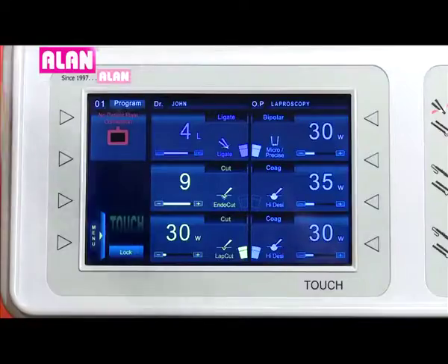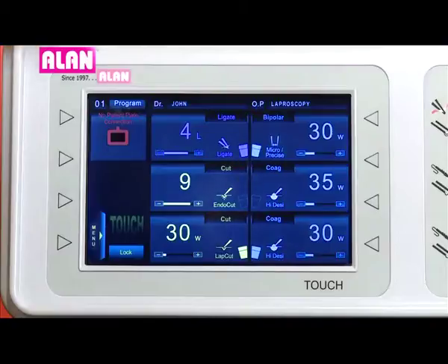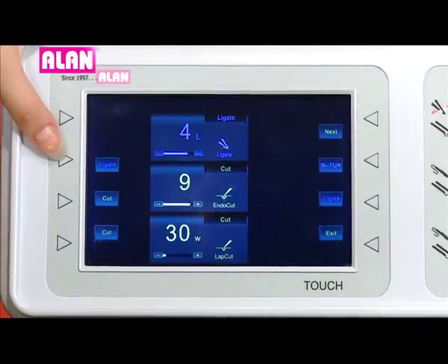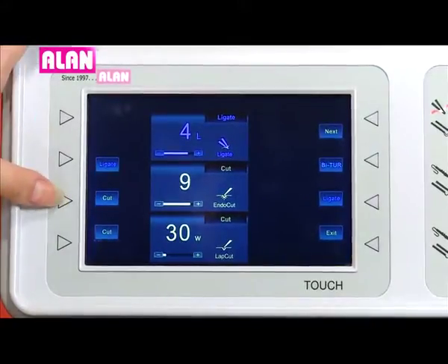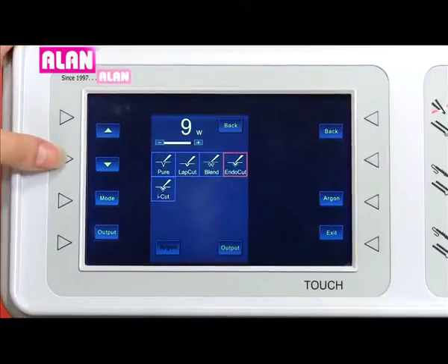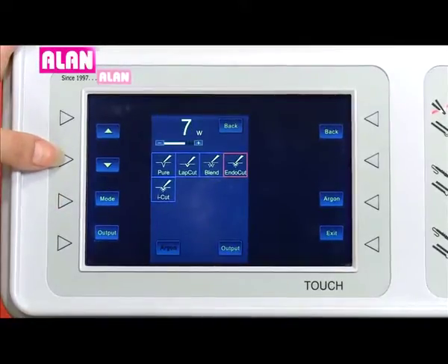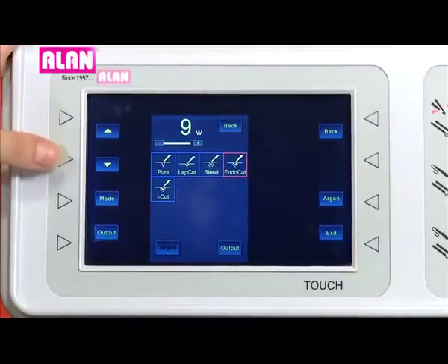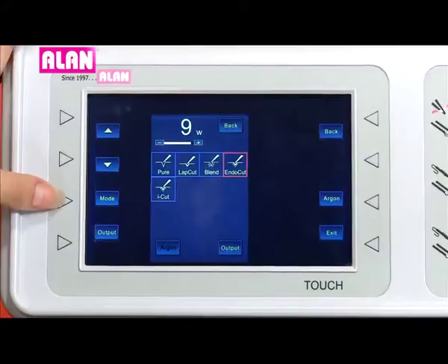The user can also use the feather touchkeys for power selection and mode selection. Press any key to select the desired mode and power level.